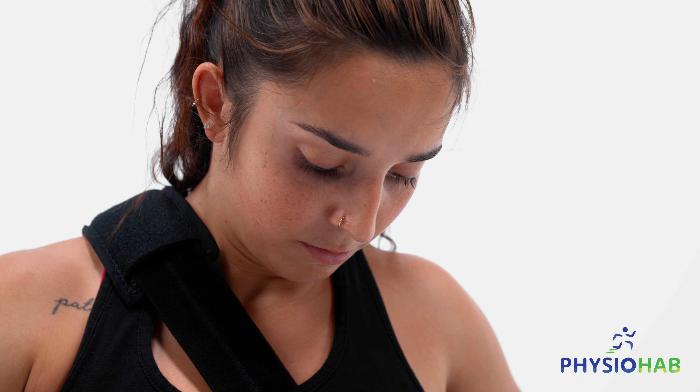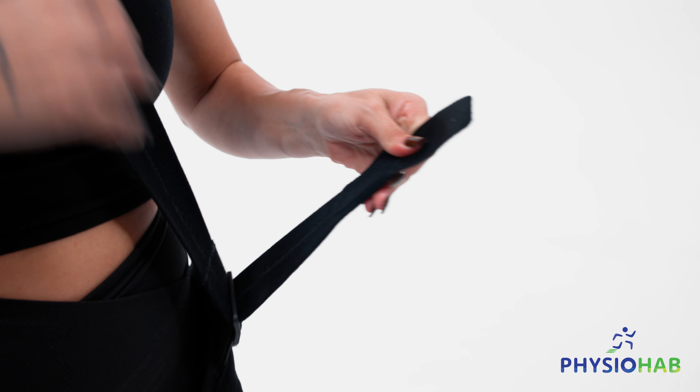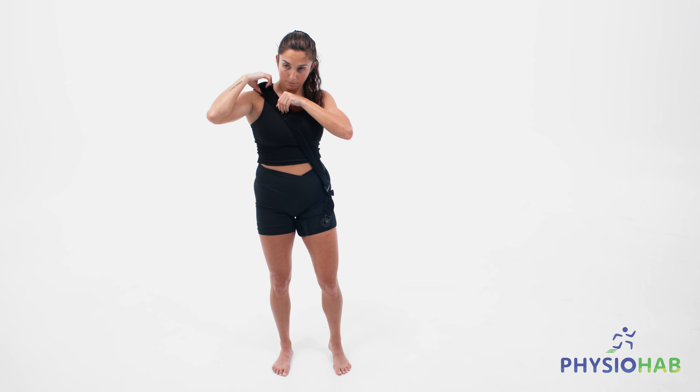Now, you can adjust the properly sized chest strap to tighten the brace. You are now ready to use the shoulder rehab brace.